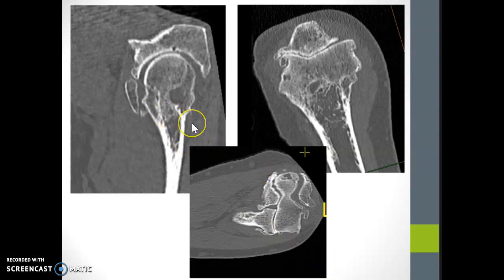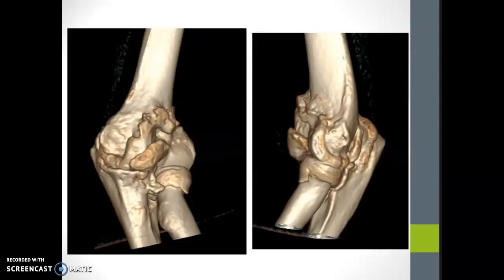And then if you look on scan, you can see cortical bone fragments on the volar surface. You can see severe OA and marginal osteophytosis as well, so lots and lots of spurs within that joint. And then if you rebuild the joint using the Clever 3D aspect, you can see exactly how rubbish and arthritic that joint is itself. So you can recreate it. You can see all those bony spurs around here.